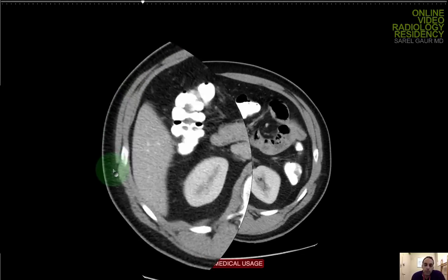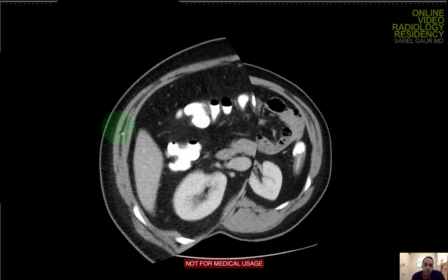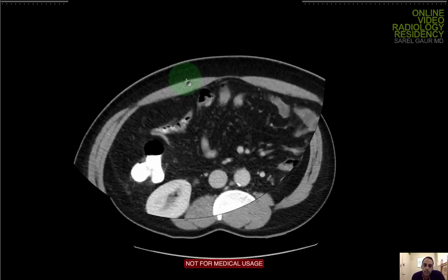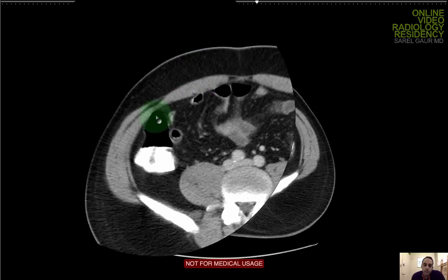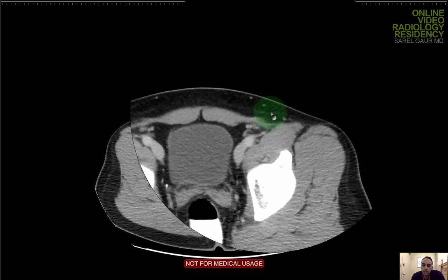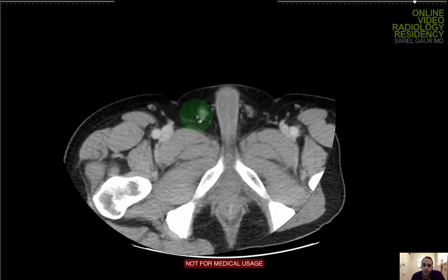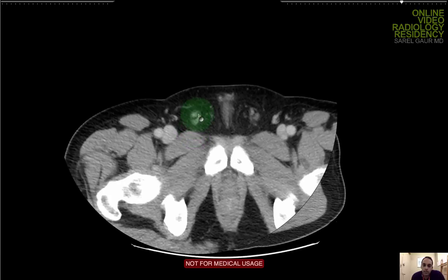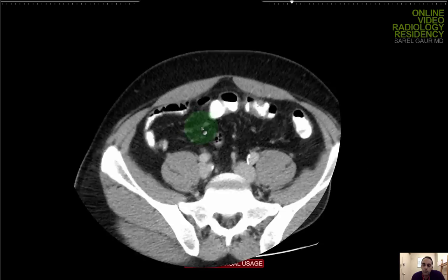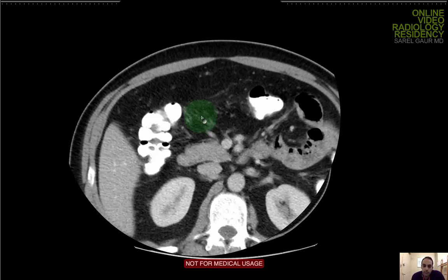Moving on to the anterior abdominal wall. I'm looking at the external oblique, internal oblique, transversalis muscle, and the recti. Looking for any herniation or thinning of the wall, and checking for any inguinal hernias. I'm seeing the spermatic cord coming out, which is a normal finding. No herniation of bowel loops or peritoneal fat. Everything looks pretty good.